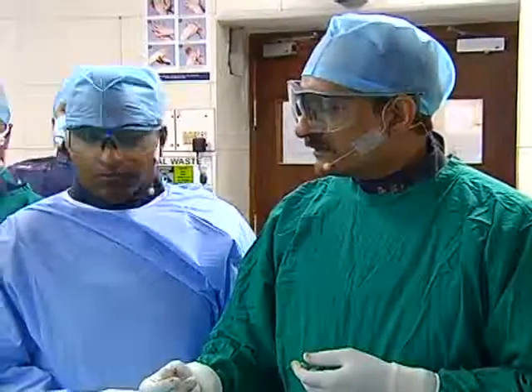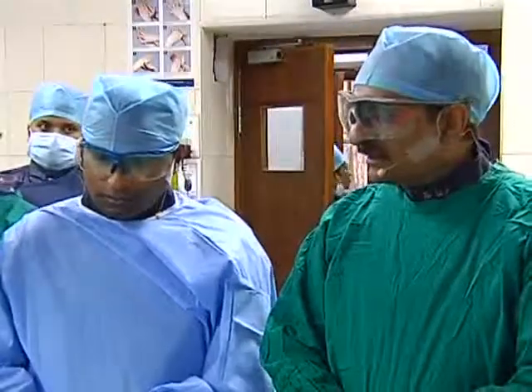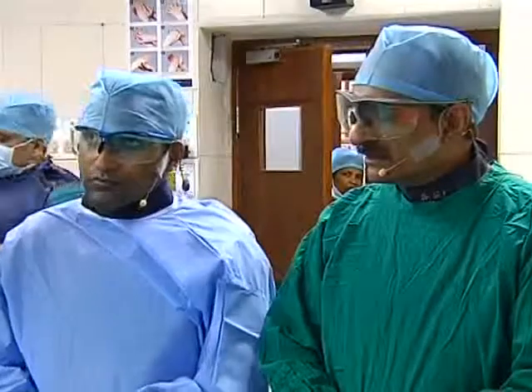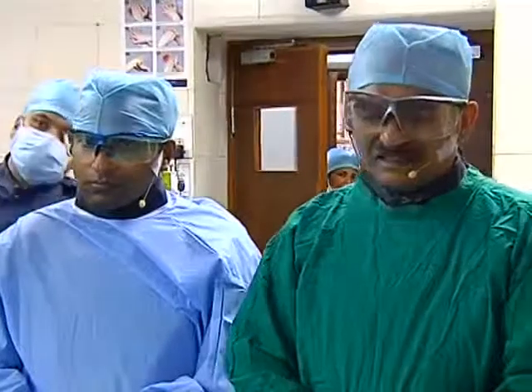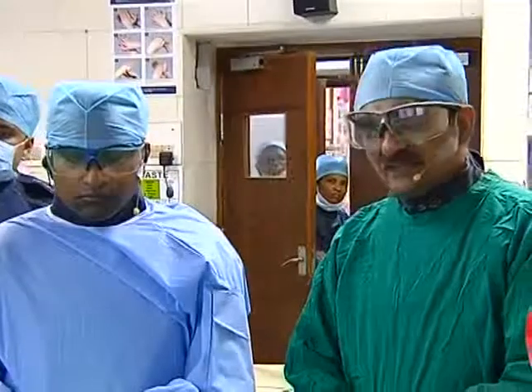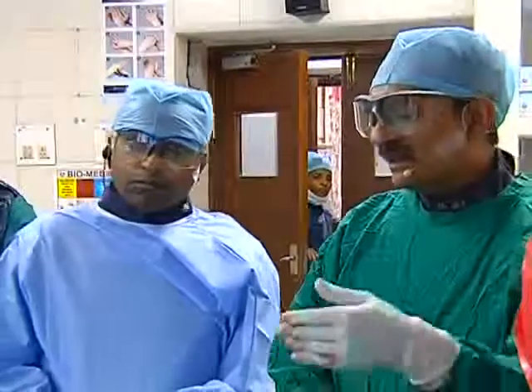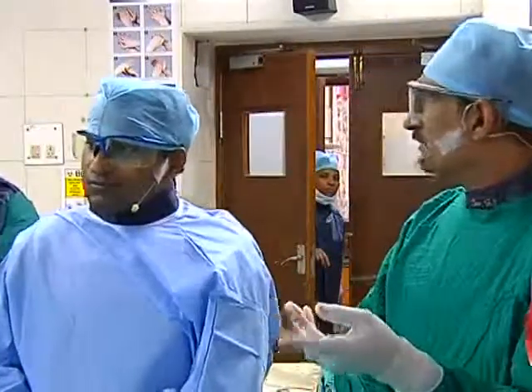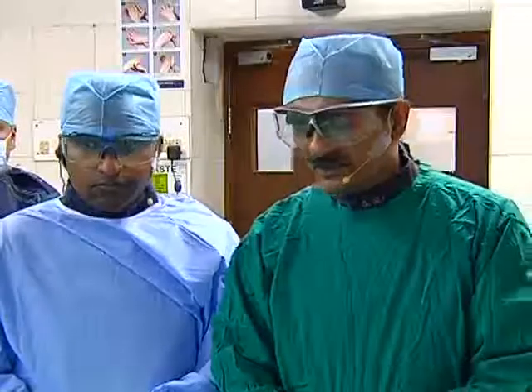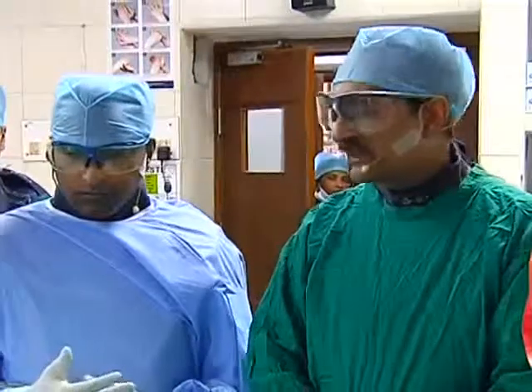George, this is Dr. Khanna. Are there any comments? Good morning, this is Dr. Khanna. Do you plan to do a percutaneous pre-close for this patient, because you are using Endurant 2 and maybe it's a good case and a simple case for doing a pre-close and then doing it percutaneously? Yeah, absolutely. Unfortunately, I haven't got onto that yet, but for the left side where I'll be putting the contralateral limb, which is about 14 French, I think, there I'll be using a closure device. So I've got a cut down only on one side, but your point is very valid. I think we should make it entirely percutaneous with closure devices on both sides.